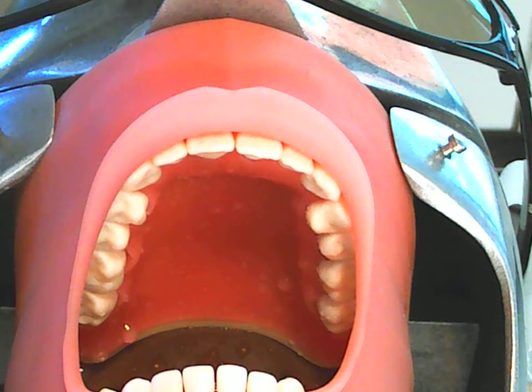If they have not had it before, you most definitely want to explain the procedure and why you use the dental dam, which would involve an explanation that it keeps the area dry, it helps the procedure go smoother with less complications of having to worry about water, and it prevents debris from falling down their throat, which is always a great asset as well.